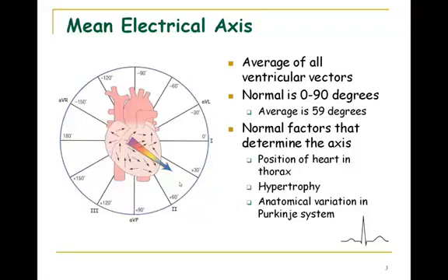So I want you to remember one of the EKG rules. If a vector is running towards the positive recording electrode, it would be an upwards deflection. So this is telling you we're running towards a positive recording electrode. If it's running parallel or pretty close to parallel to the lead axis, it'll give you your maximum deflection.